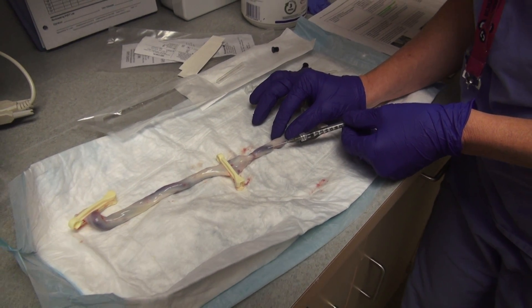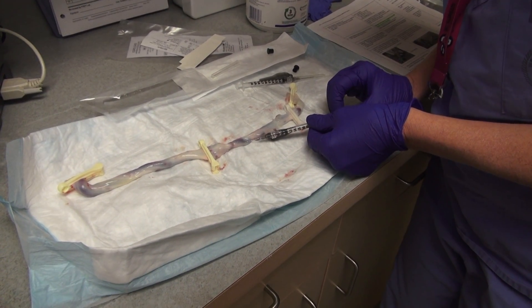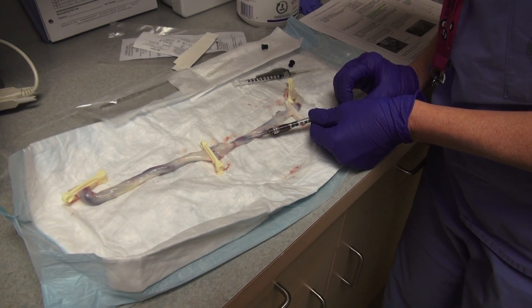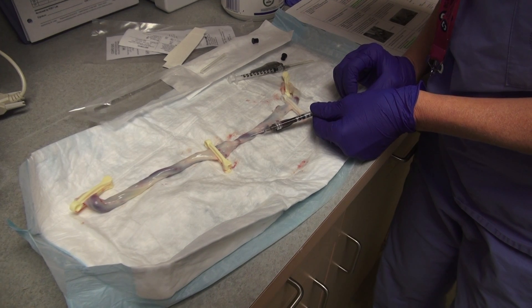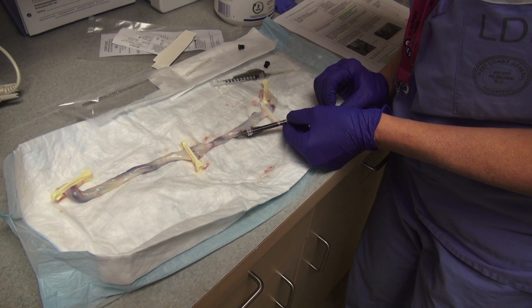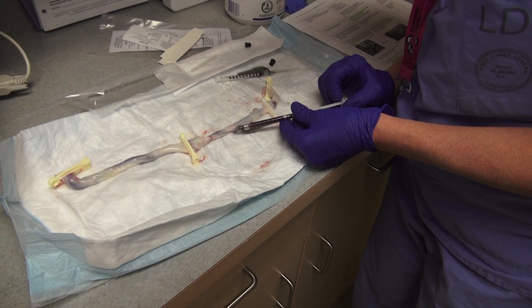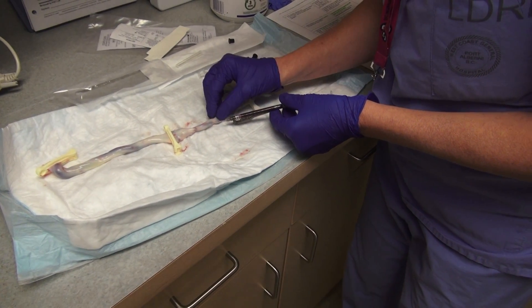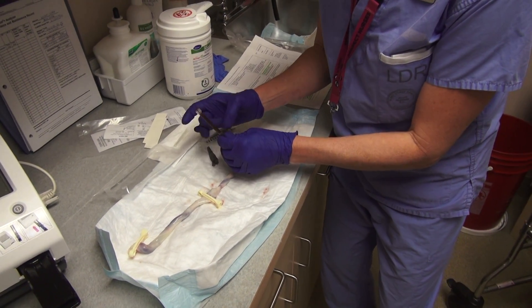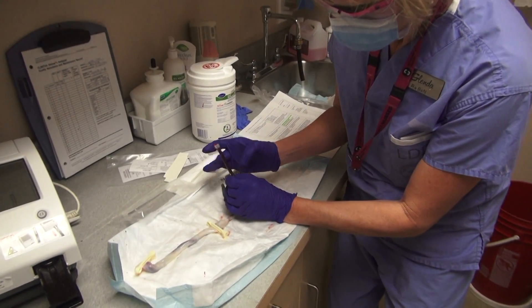I'm going in at 45 degrees and then as I get in I'm pulling up blood. If we can get up to 1 mL that is great, but even 0.5 mL is doable — whatever you can pull up. Here you can see the umbilical vein is really giving me a good amount, which is great. I'm getting a full amount there, so I'm going to release that, close that off, and take that off. Now before I put the cap on I just want to tap down.